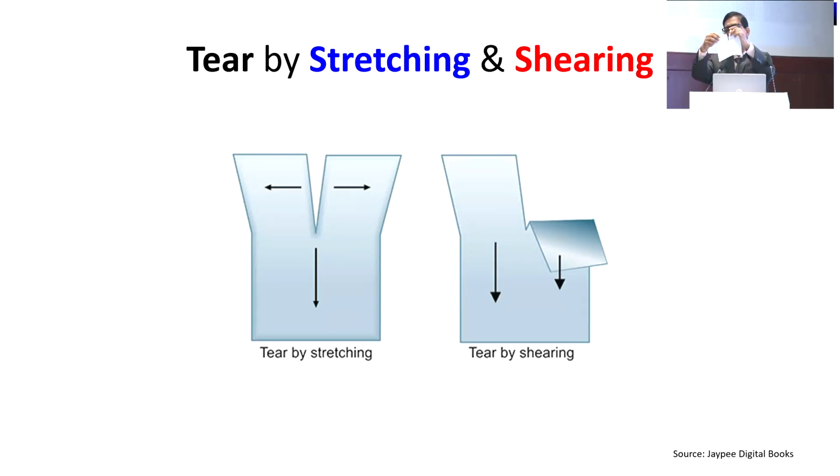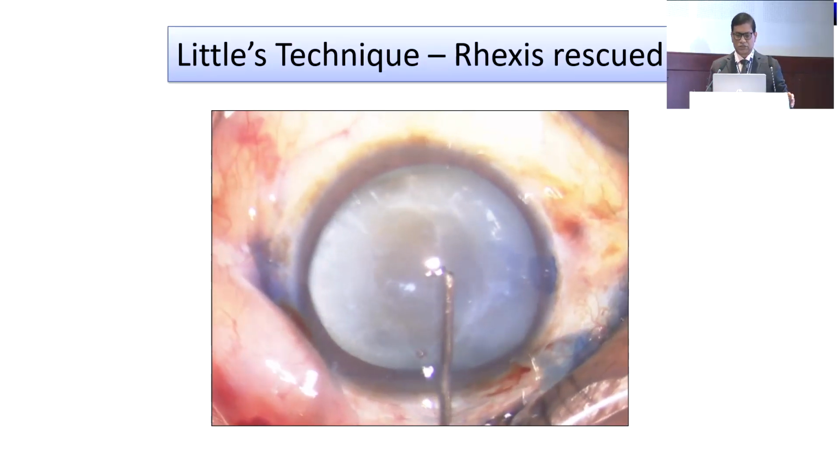If you're doing this, you hold this, keep this stable, see which direction it goes. It moves towards my hand. So you pull it in the plane, it moves in that direction. And that's something you can practice at home, and once you gain experience, it feels a little scary. You feel that it'll go out, but it always turns back. So now let's see this.